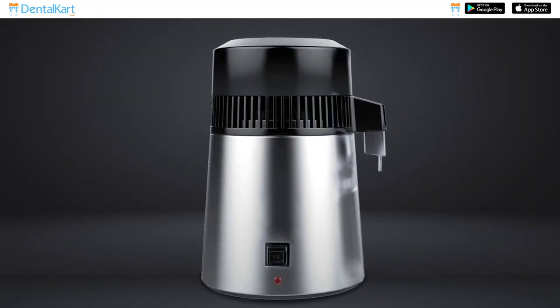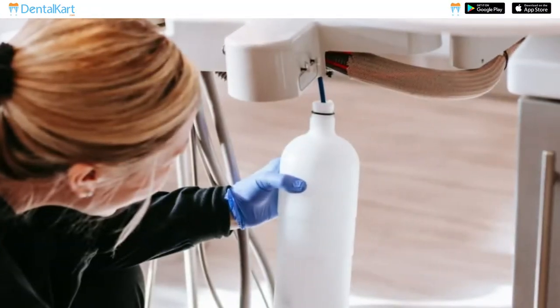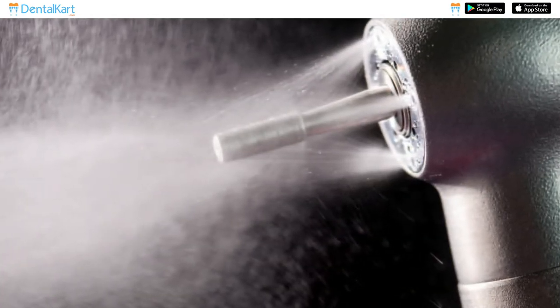Walden Water Distiller converts tap water into distilled water by boiling it into vapor and condensing it back into liquid form. It allows dentists to take control of their own distilled water supply to ensure patient safety and to protect their expensive dental equipment.